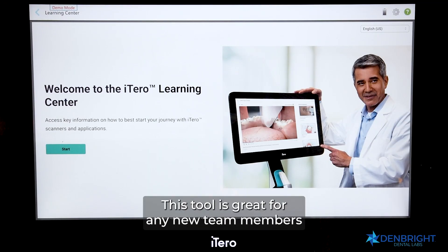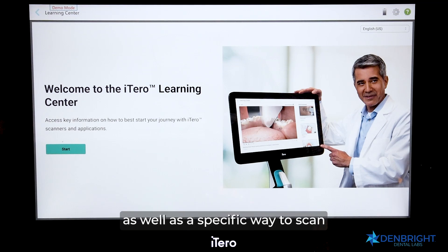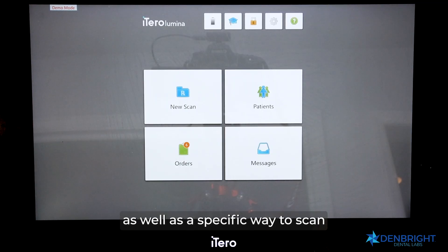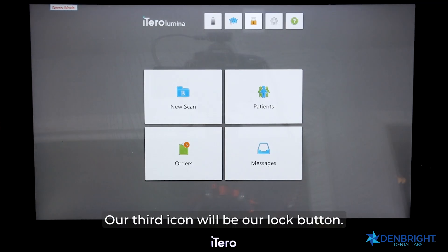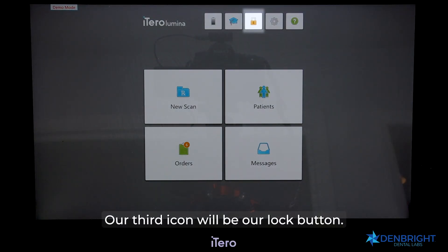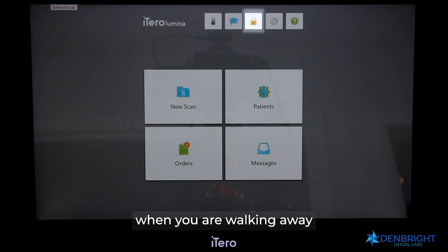Our second tool is the Education cap — this is our learning center. It's great for new team members, learning new tools, or scanning a specific case type. Our third icon is the Lock button, used for HIPAA purposes to close down the scanner when walking away or to switch between users such as from one doctor to another.